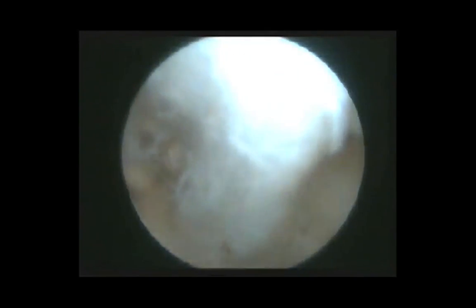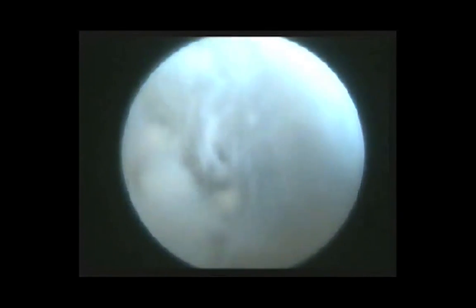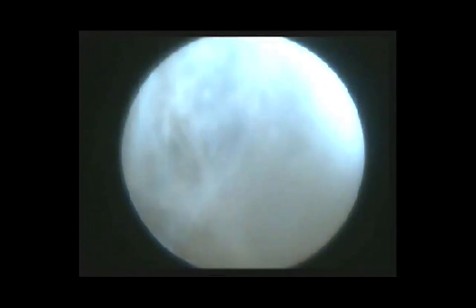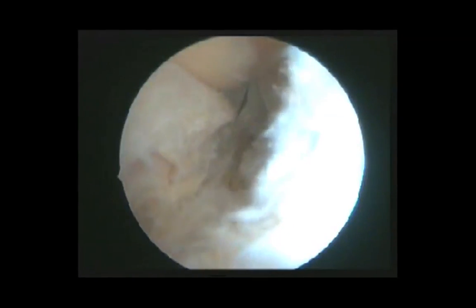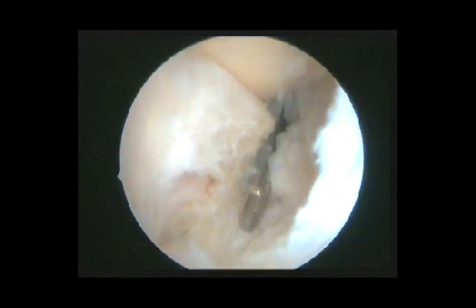The anterior extent of the cyst has been addressed anteriorly, and now we are taking down the last fibers of the cyst wall that have extended far medially into the posterior medial compartment. A thorough debridement is a must, and for this we can repeatedly switch portals, since viewing from the posterior medial portal and posterior lateral portal can help us visualize and address the last remnants of the cyst wall.